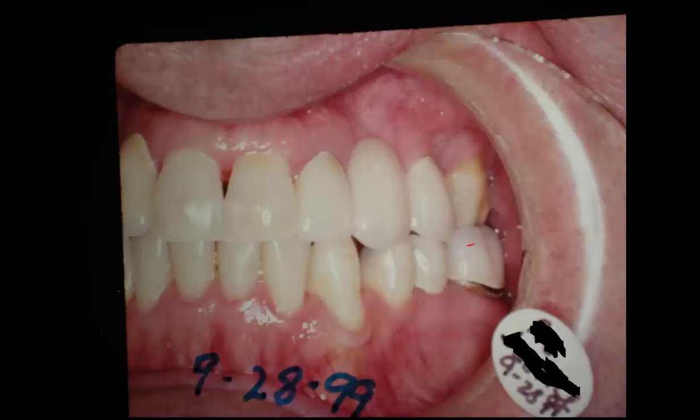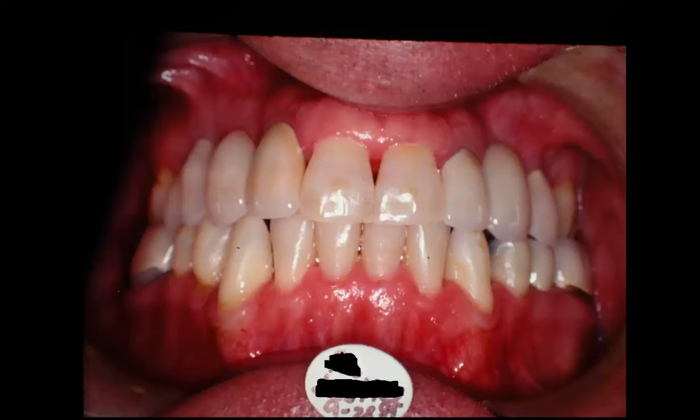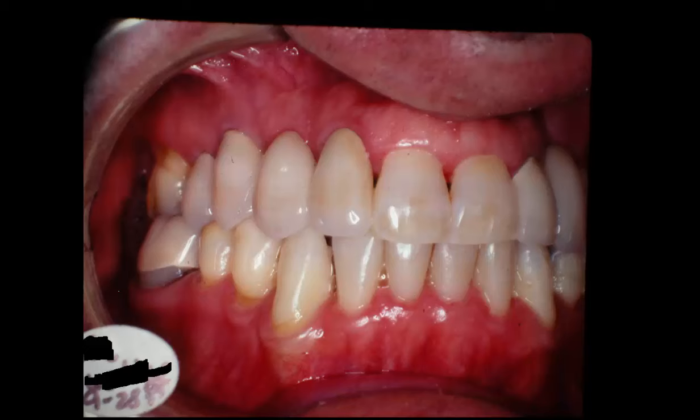Now he had a big, thick crown back here that we didn't want to shove in all that much. So we let this tooth kind of close underneath that so it can still slide back and forth in its occlusion without too much interference with that. Now the midline's slightly off, but compared to what his smile was, he's got a fantastic smile. Now this is another finish shot a little later on down the line. And I watched this guy for years after we finished, and this thing held up just really good. And he looks like he's a little happier now.